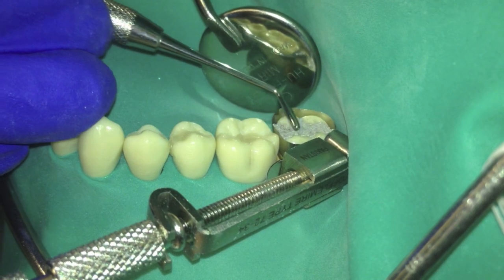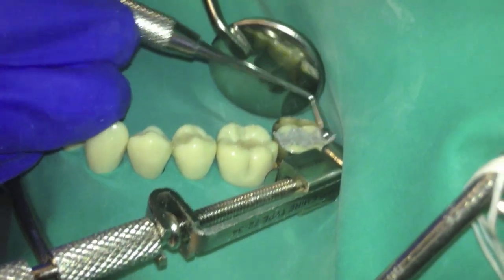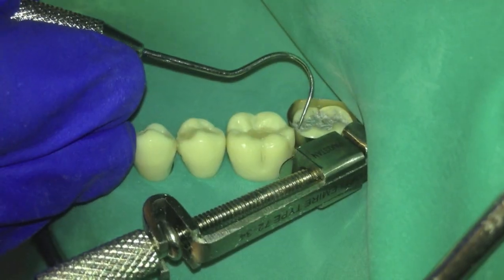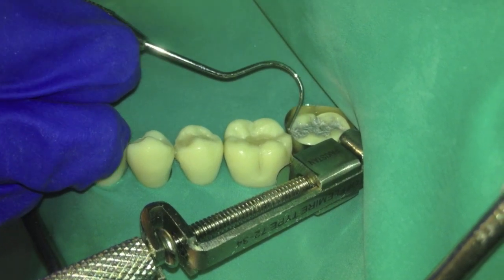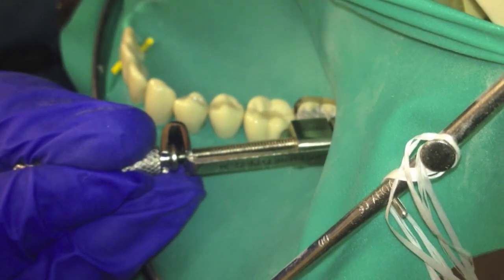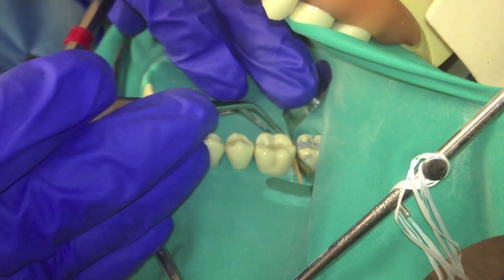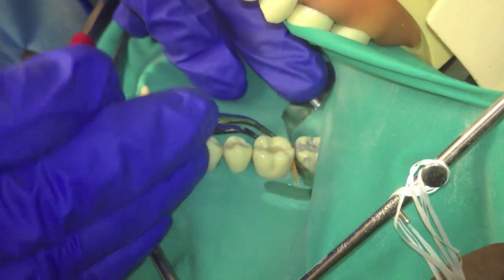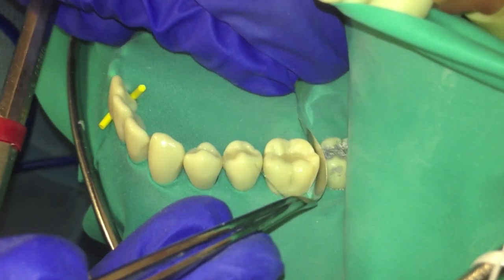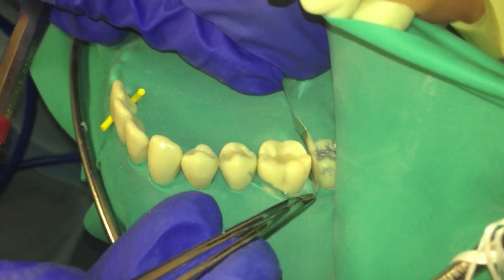A burnisher is used to seal the cavo surface margins. An explorer is used to clear the amalgam from the matrix band. Provide support to the band when removing the Tofflemire retainer. Remove the wedge gently. Tease the band with forces applied towards the adjacent tooth.